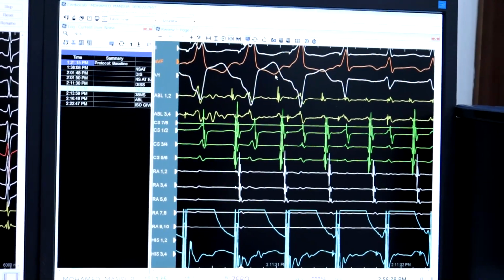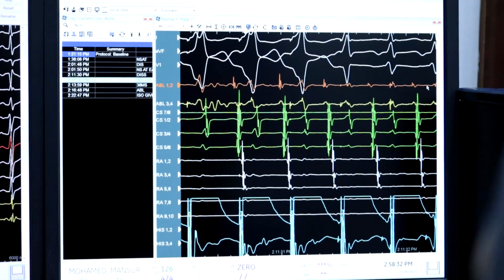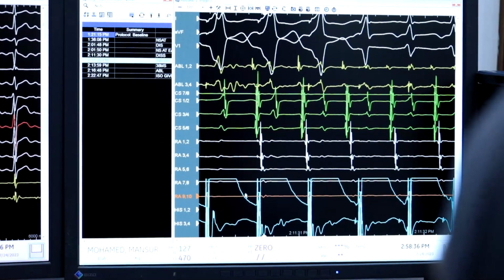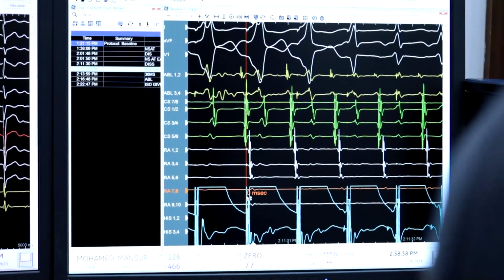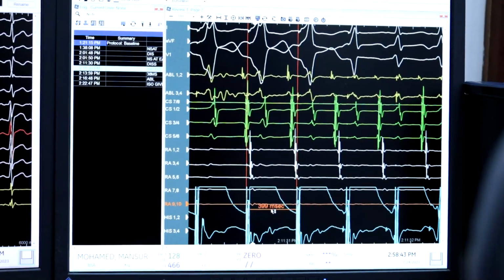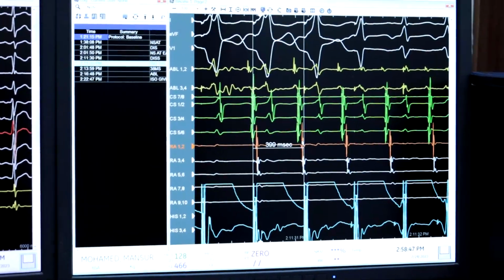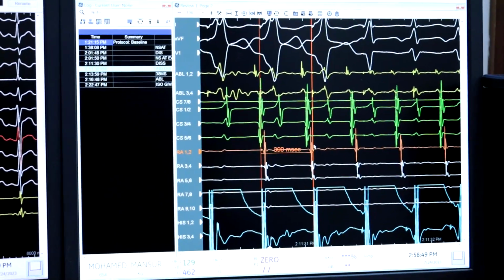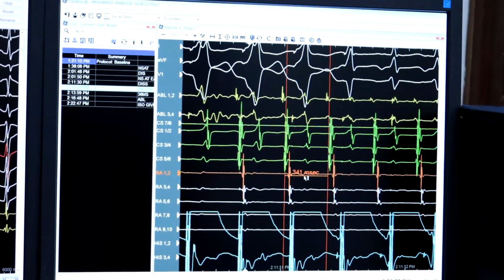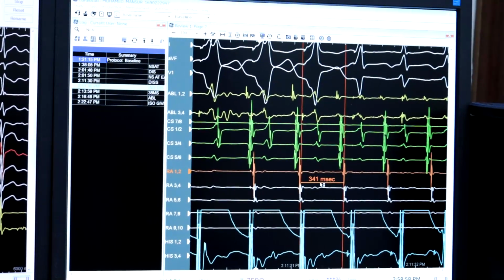The 3 beats are fully paced from the right ventricle, and this one is fusion, and then the running tachycardia. So in order to demonstrate VA dissociation during tachycardia, I have to measure the VV and then take the caliper and go here. Here the tachycardia is completely different, dissociated from the V pacing. This is the tachycardia, and it is completely different from the V pacing.